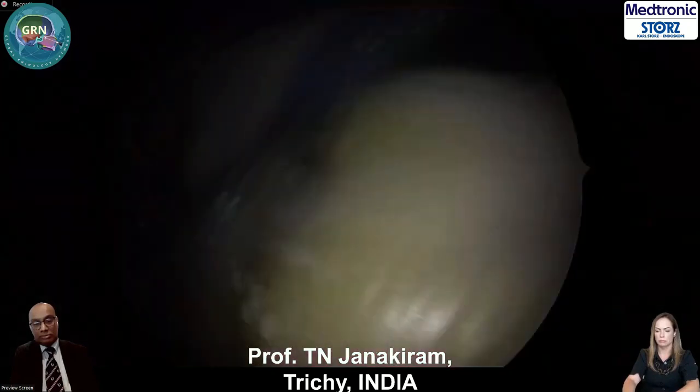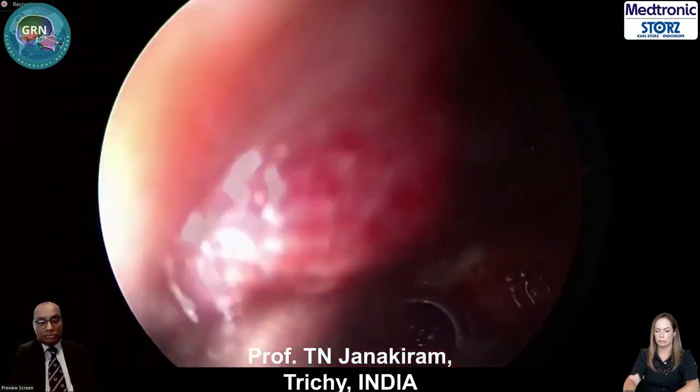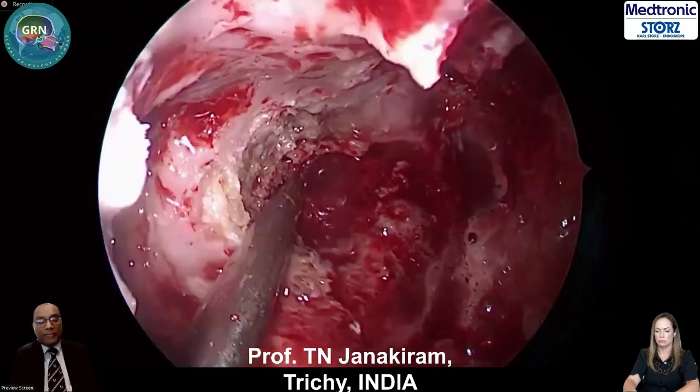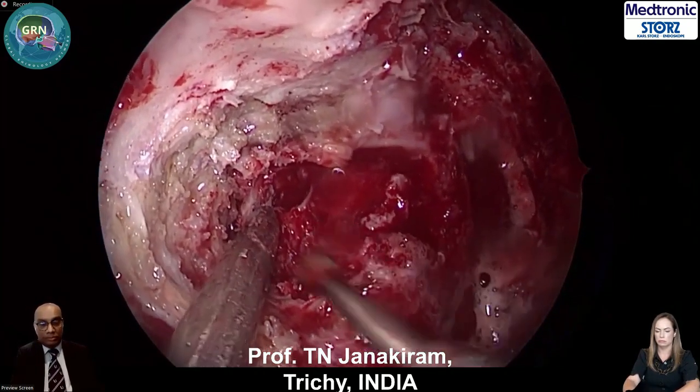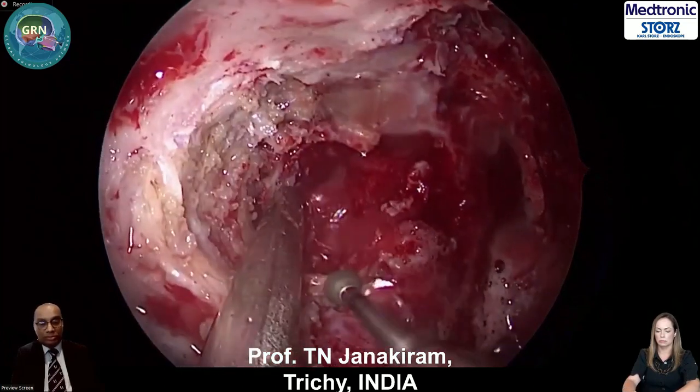Okay, so I've almost exposed the whole lateral part of the JNA now. So it's all about exposure. Again and again, I say it's all about the exposure. It's nothing else but the exposure. That's the medial pterygoid plate.